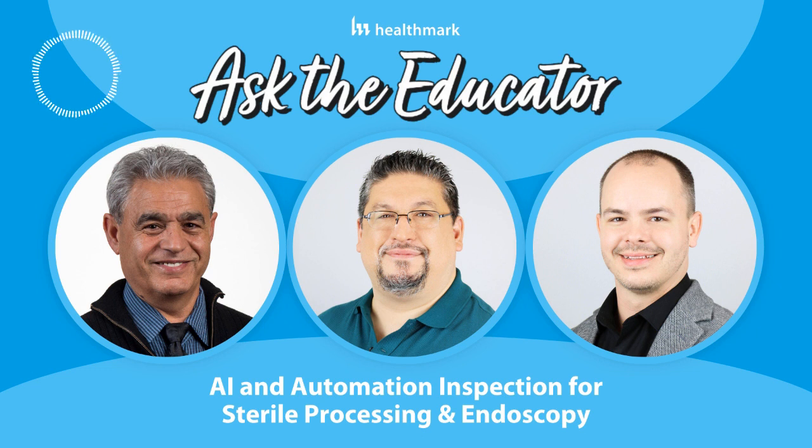And it talks about how you need to use, or recommends, some kind of borescope to look into that, for enhanced visualization. And obviously, high-risk endoscopes, you need to look inside them a little more so they are free of debris. So really, all the organizations are talking about some kind of inspection as part of the quality system. Yeah, and I think that we're seeing that more because now there's more evidence too.